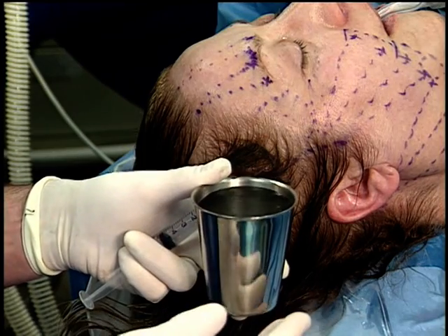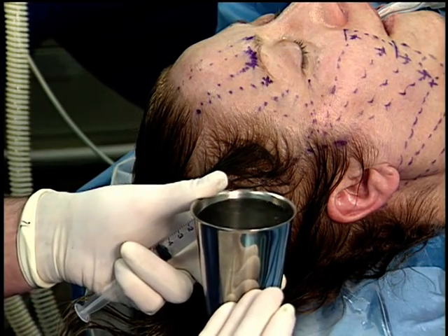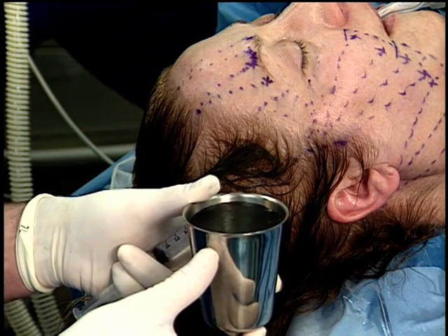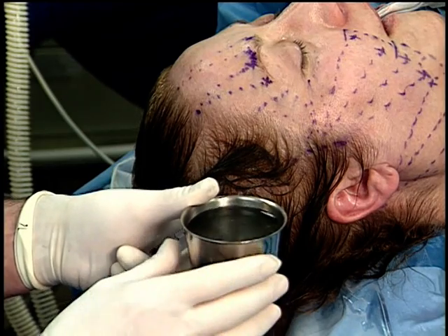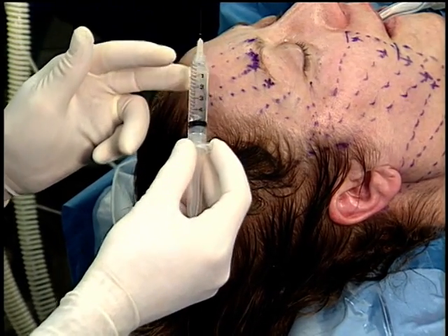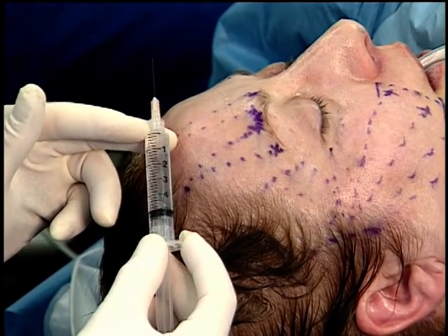In the plastic surgery literature, there's some evidence that that 20 mil in that dilution amount gives the optimal buffering of the pH and minimizes the pain and discomfort. So we end up with 120 cc's of about 0.48%, 1 in 200,000. What that gives me is about 120 mils of solution. And as I infiltrate, you will see I use this 5 cc syringe and I do a tumescent tunneling technique. If I use about 10 to 11 of these on each side, I will use about 50 to 60 mils on each side, or 120 mils on both sides.